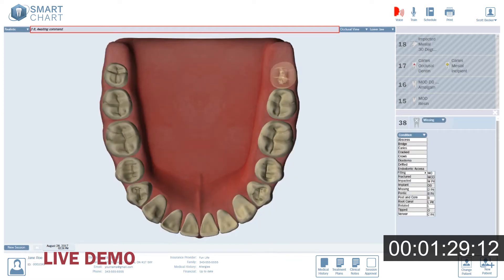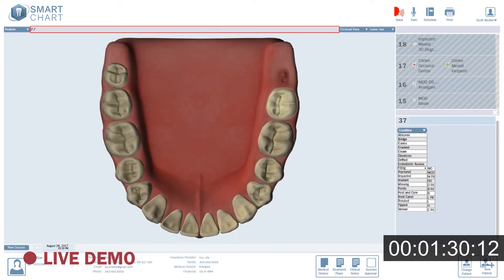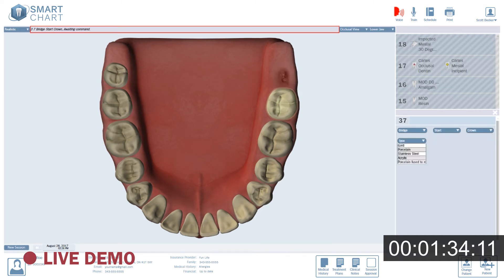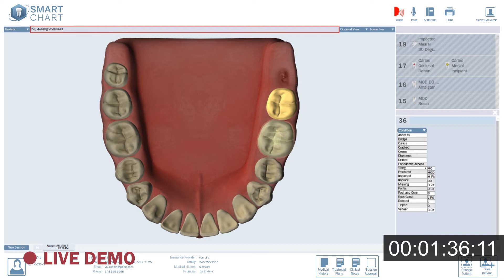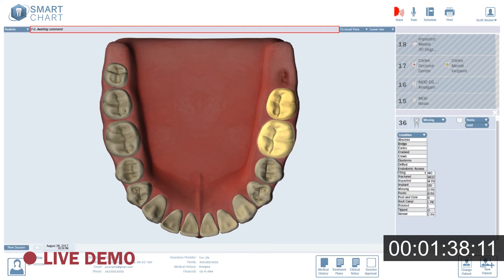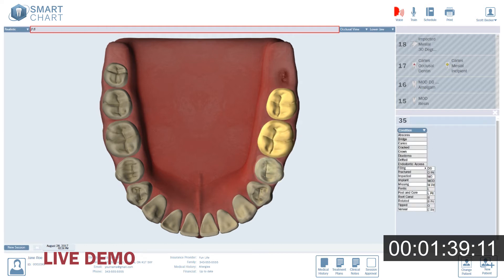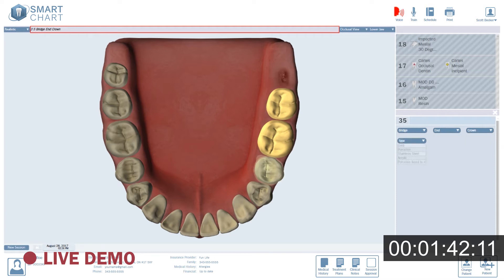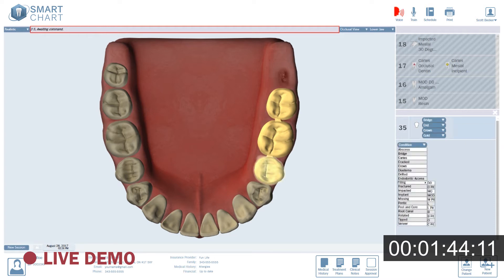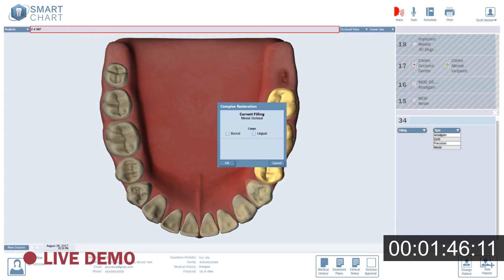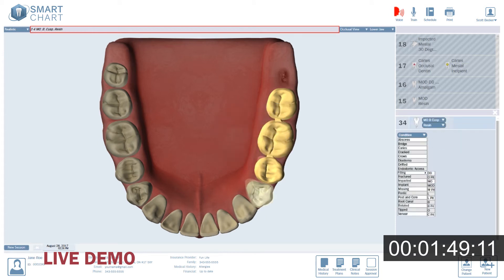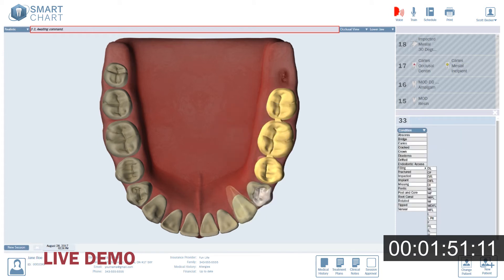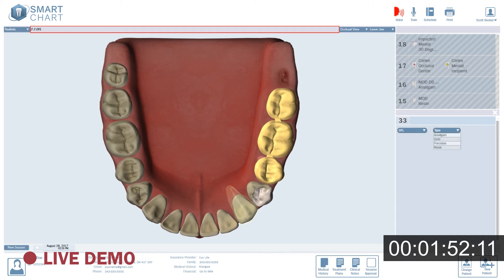3.7. Bridge. Start. Crown. Gold. 3.6. Pontic. Gold. 3.5. Bridge. End. Crown. Gold. 3.4. Mo. Buckle cusp. Resin. 3.3. DFL. Resin.